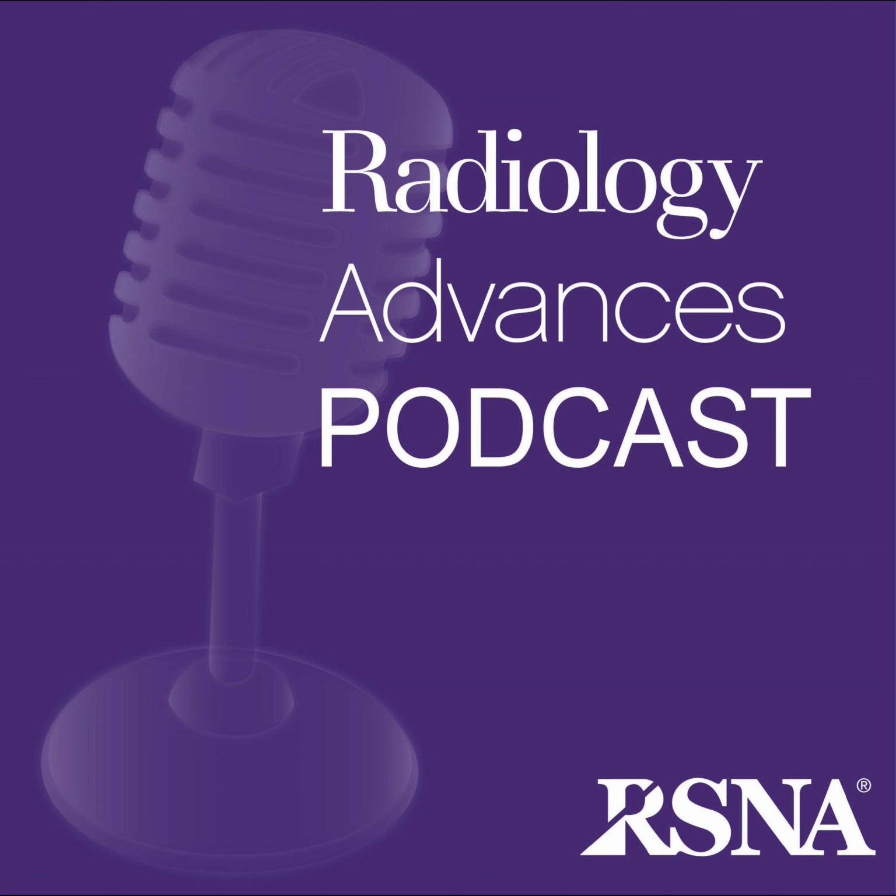And the numbers back that up. How good were the synthetic images? The fidelity was extremely high. They reported a PSNR of 35.37. And for our audience, anything over 30 is generally considered excellent, so it's very good. It means the synthesized image really replicated the voxel intensities, but more importantly, they look at structural integrity. The Structural Similarity Index measure, or SSIM, was 0.970. That's incredibly close to a perfect match of 1. These metrics together confirm the output didn't just look good, it kept the structural information you need for segmentation.